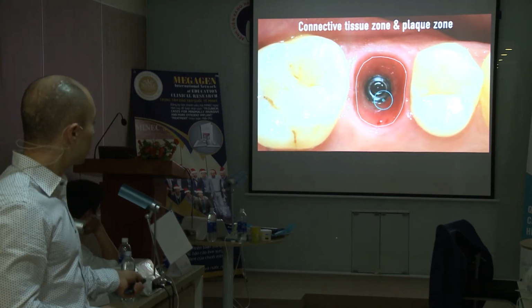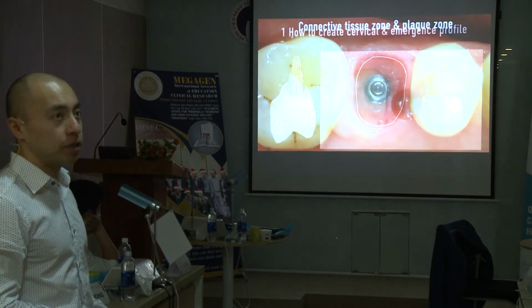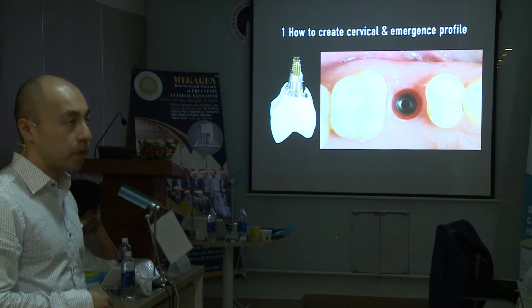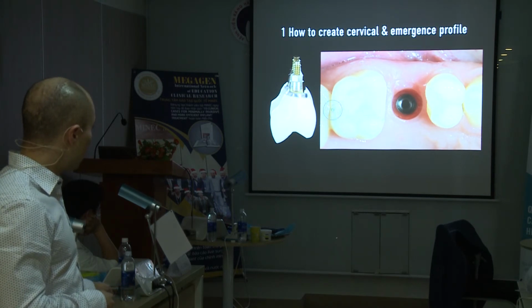And this is the implant, if you haven't noticed. So we have three ways to create this cervical and emergence profile. One is we just make the crown and we press it in.